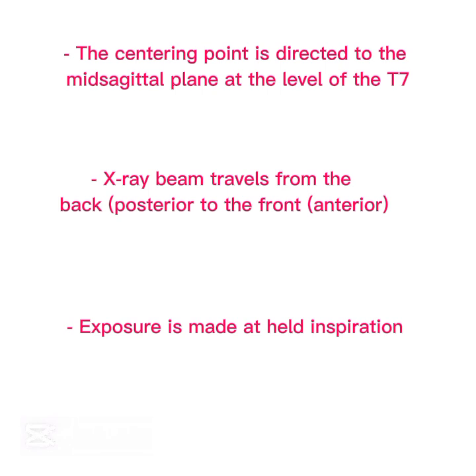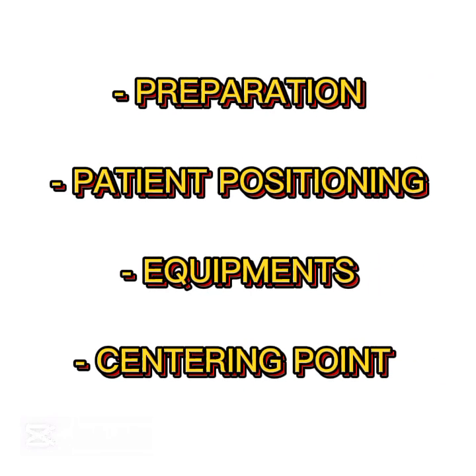So for chest X-ray PA technique, those are the rudiments. We can look at the preparation, the patient positioning, equipment, and centering point. Those are the rudiments we can look at for chest X-ray PA technique. These things are very key, they are very essential when you are carrying out a chest X-ray PA technique.